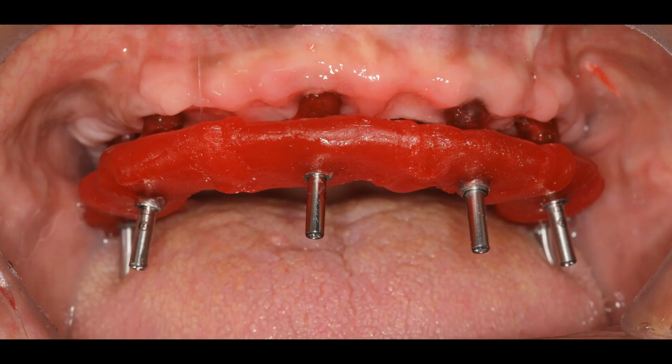This is called an impression jig, and what we do is we place impression copings on the implants and then we connect them all together with a dimensionally stable acrylic resin. This helps with accuracy, and it also gives us a framework on which to wax the prototype.